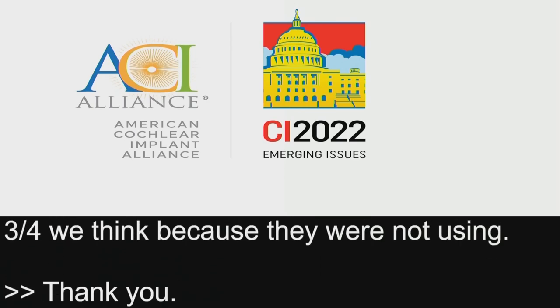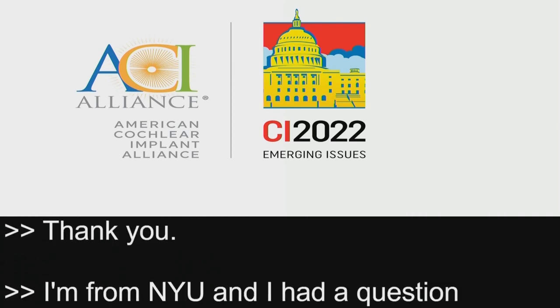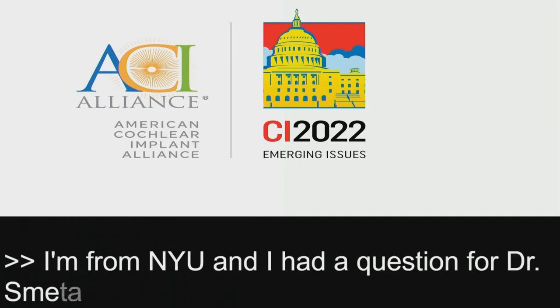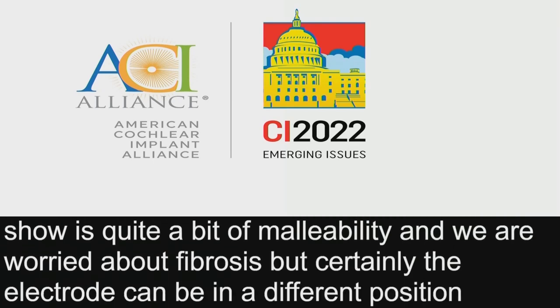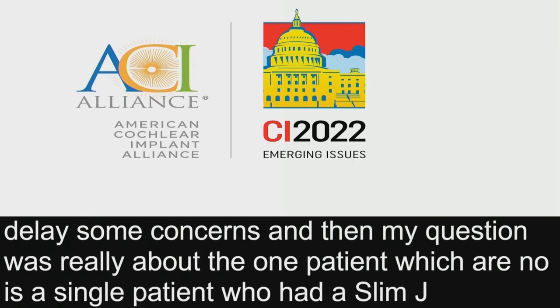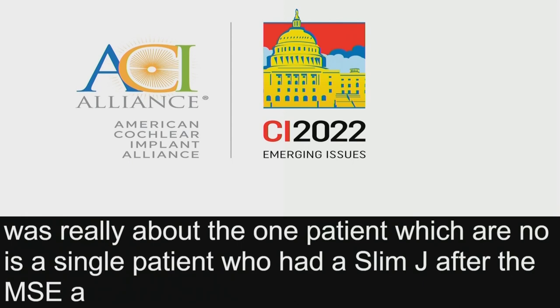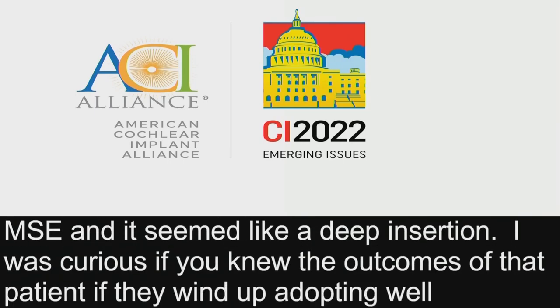Hi, Dan from NYU. I had a question for Dr. Smitak and a comment. I think that your study and some of ours show that there is quite a bit of malleability, and we're worried about fibrosis, but certainly the electrode can be in a different position, so that allays some of the concerns. And then my question was really just about the one patient, which I know is a single patient, who had a slim J after the MSE, and that seemed like quite a deep insertion, which is similar to the one that we presented where we pulled it back. I was just curious if you knew the outcomes on that patient, if they wind up adapting very well, or if there's any consideration that you're missing portions of the basal turn there.